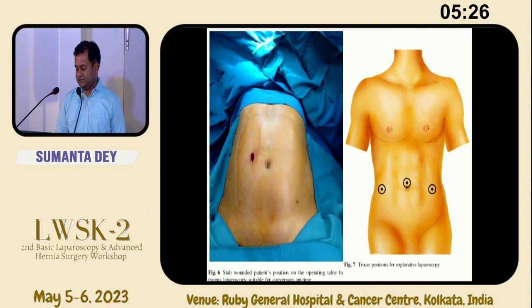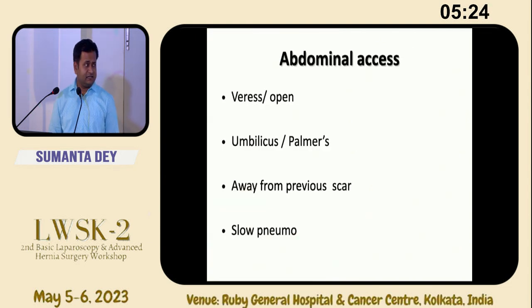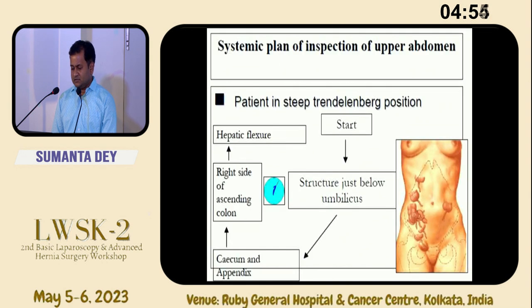And abdominal access, how do you get it? There are different methods, like Veress, or you can do open, whichever you are comfortable with. You can get access at the umbilicus or Palmer's point, but you should definitely stay away from any previous operative scar. Pneumoperitoneum should be slow. In acute cases, if the patients are already hypotensive and you inflate the abdomen too quickly, sudden cardiogenic or hypotensive shock can occur. So slow inflation of the abdomen is advised.